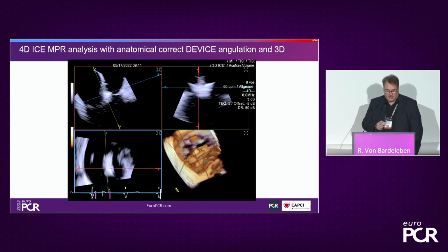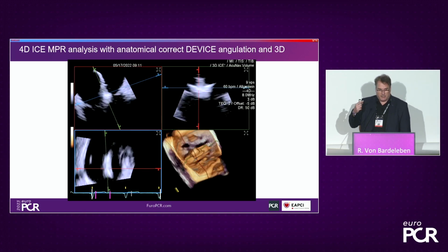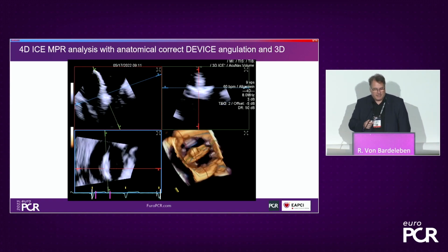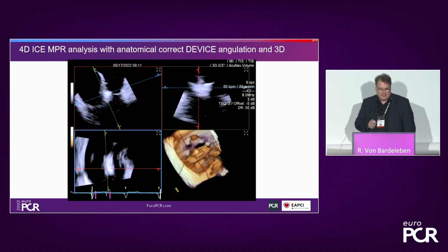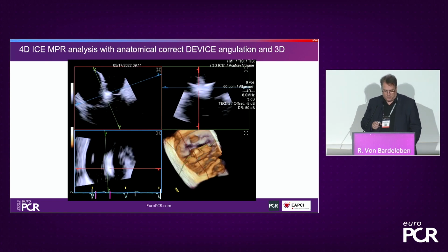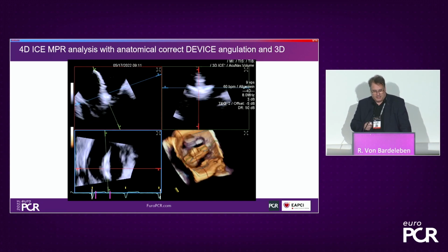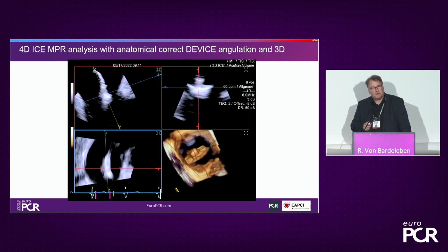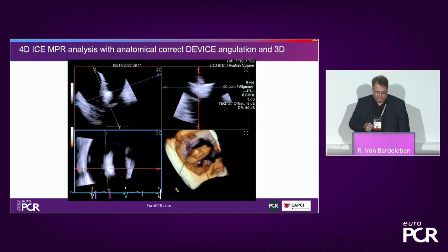Now we're entering via fluoroscopy and also ICE catheter. We can retract the ICE, we can retroangulate the ICE in order to see also bicaval views. And here we're entering down with a device into the level of the tricuspid valve. You can see just by aligning the different situations that we counterclock according to the device arm. We're also clocking the situation according to the extension of the device, and we can see its position three-dimensionally in the tricuspid annulus, including the motion of the leaflets.